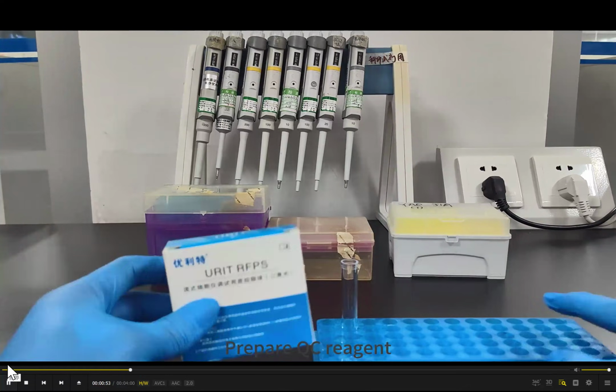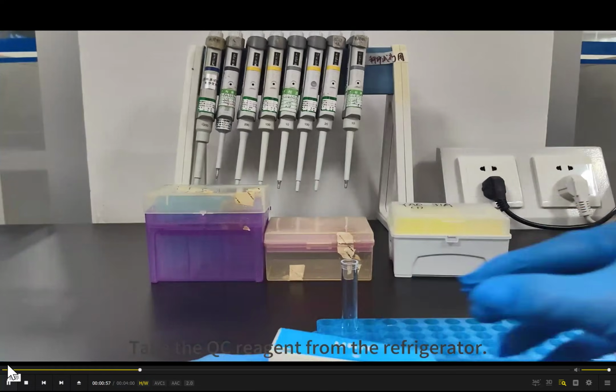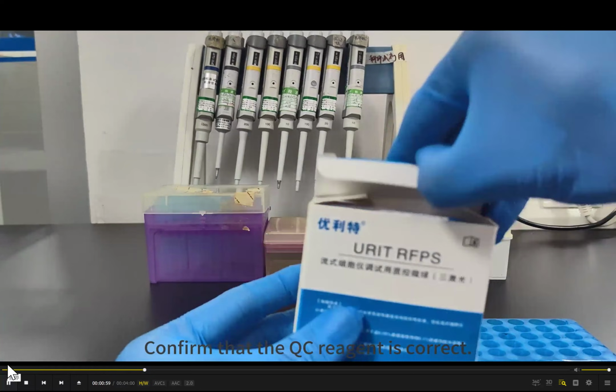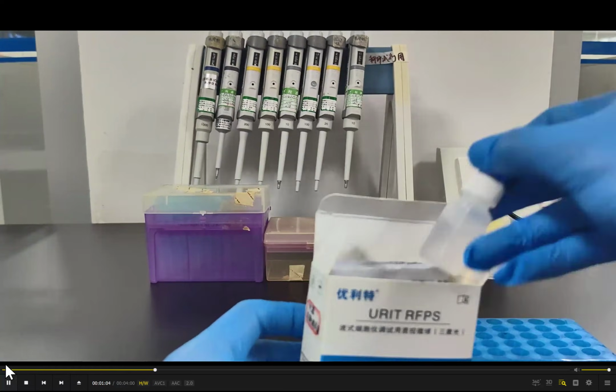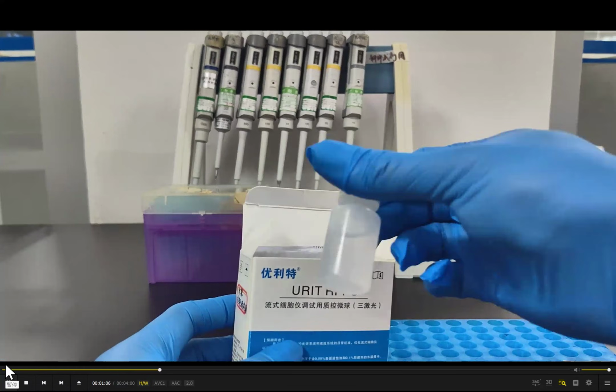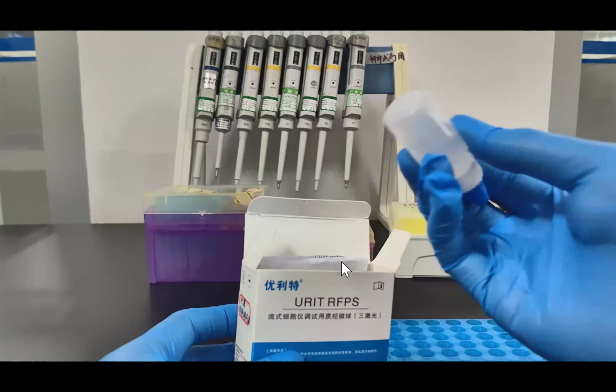Quality control test. Prepare QC reagent. Take the QC reagent from the refrigerator. Confirm that the QC reagent is correct. Why I say here to confirm that the QC reagent is correct: you need to check if the reagent is the right type, because we have two types.